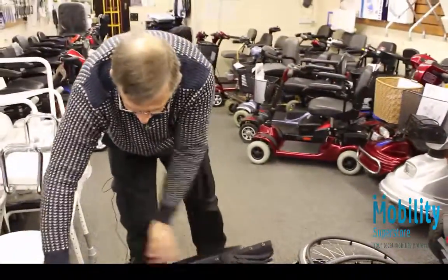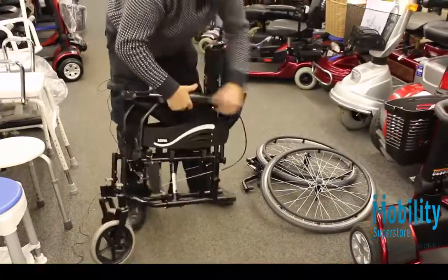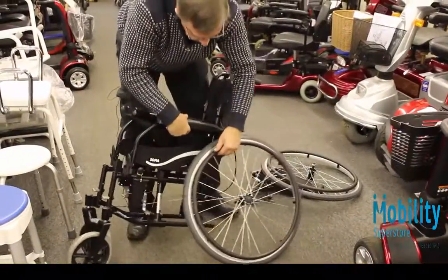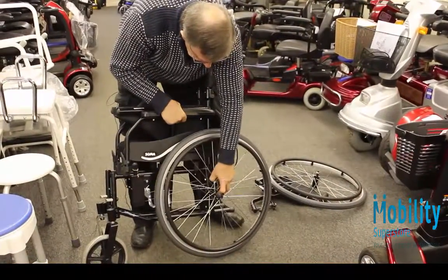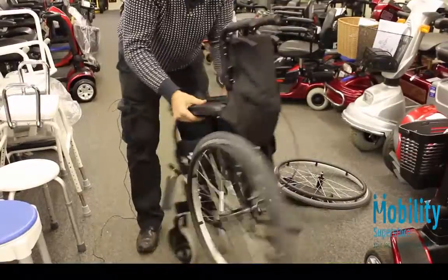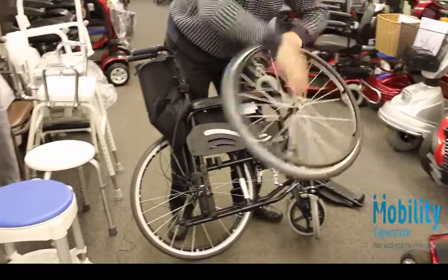It's extremely easy to put it back together. Put the handles up, take hold of the wheel, make sure you put it in the right hole in the chair otherwise it would be an embarrassment. Turn it round because it's easier to have the weight on the wheel, then bring your other wheel up.